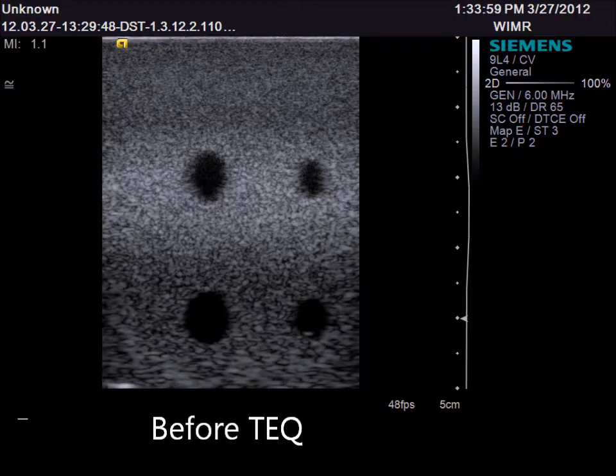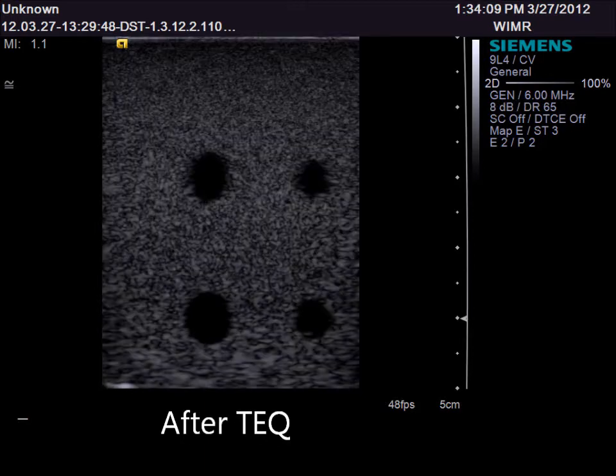Before TEQ, notice the grainy appearance of the structures in this phantom. After TEQ is applied, one can note a decrease in the overall gain, equalizing the weak and strong signals, creating a more crisp and clear appearance of the objects in the phantom.